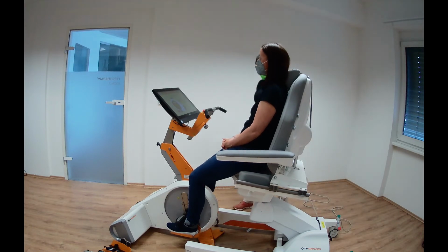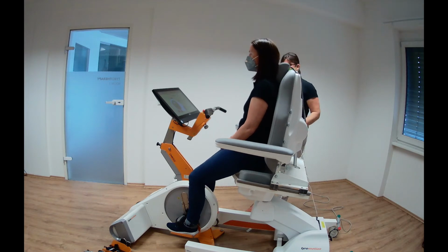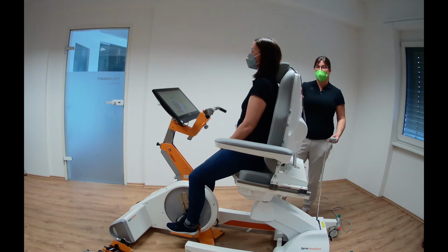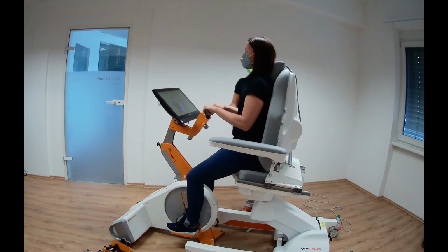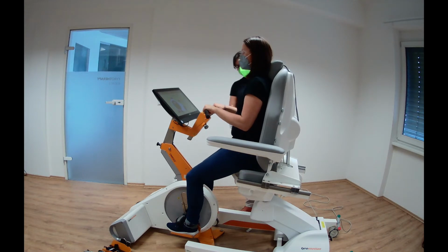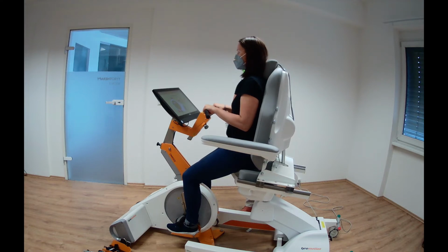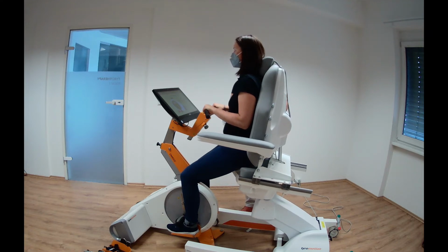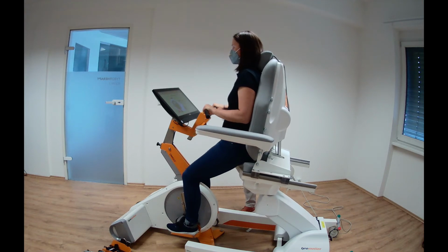So we can adjust the height, and we can also adjust the position of the backrest. Right now we want to have Barbara in a more or less upright position, and we can also move the whole backrest a little bit forward or backward. So to bring her in this almost standing position, we shift the backrest as close as possible to Omego. And with that, we can also increase the height a little bit. All right.